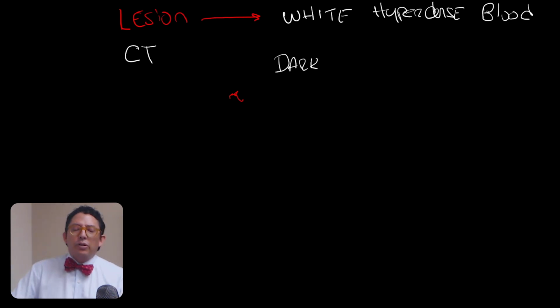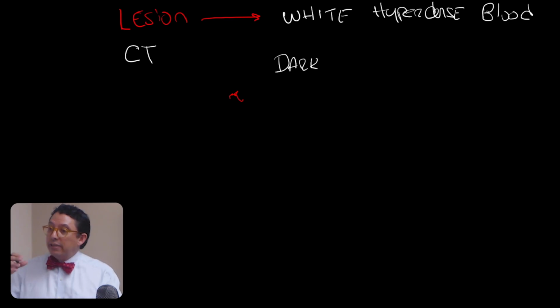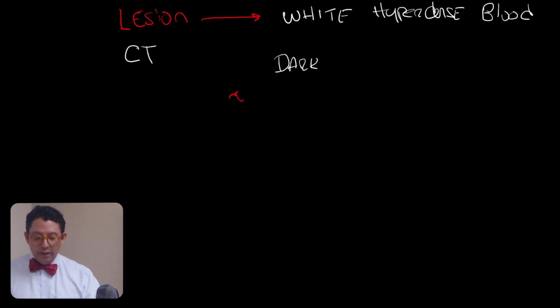Great. So if the patient had fluids in the field and had a big trauma, when you do fluid replacement because they lost blood, they put in lactate, they put in saline. These things do not have the iron that you have in blood, so you can actually have acute bleeds that are not as dense as you would expect because of the lack of iron. So remember that in CT, it's the iron that gives you the blood.